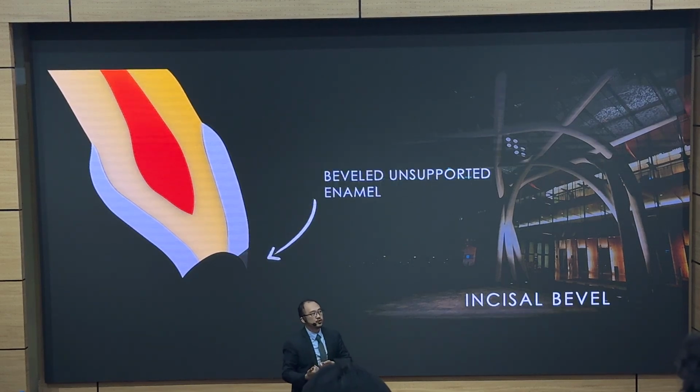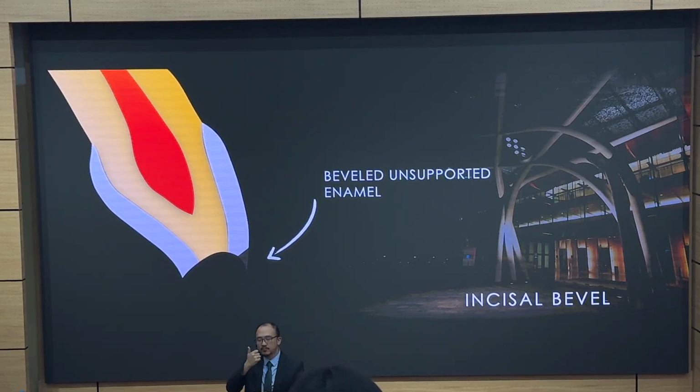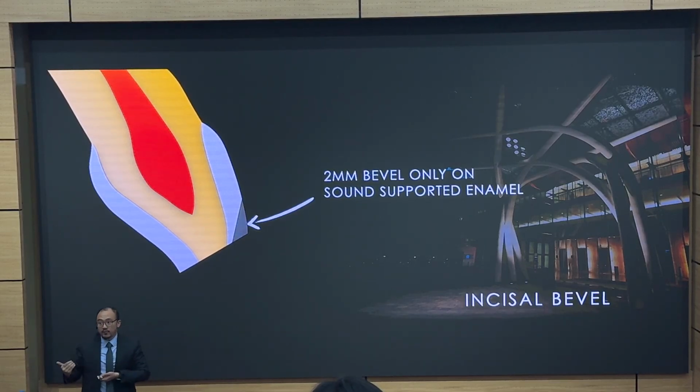What I should do instead is that after I do my caries removal, I must always remove all the unsupported enamel first, before I do my beveling. So I know I am beveling on healthy enamel. This is number one, to eliminate the white lines. The second thing to remember is that when you're beveling, you have to make sure you're beveling on enamel.